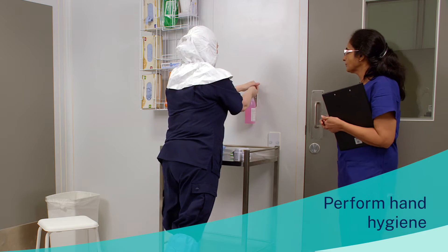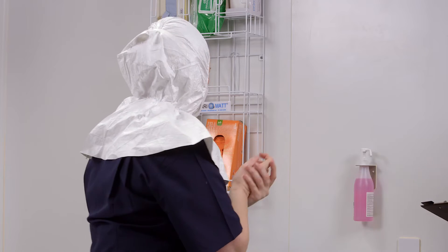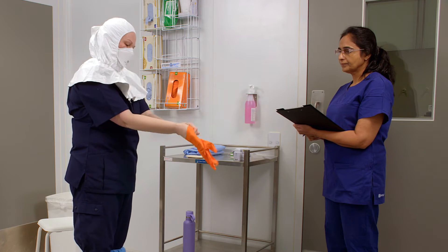Perform hand hygiene. Don the inner gloves. If available, use long cuffed gloves.